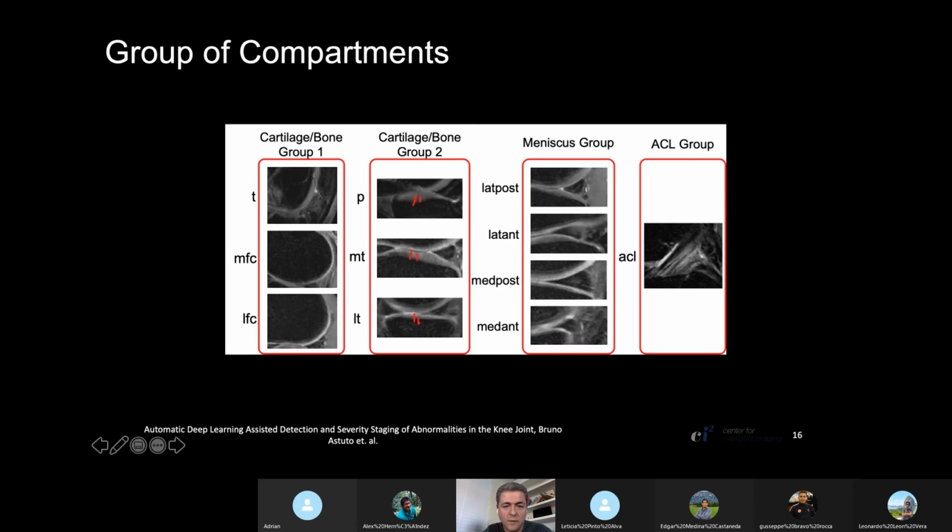So in one model, we classify the bright part, which is the cartilage. The other model, for bone, looks into the dark part here, which is the bone. Sometimes the cropping doesn't give us much of the bone, and I think the lesions might not be in the cropping.